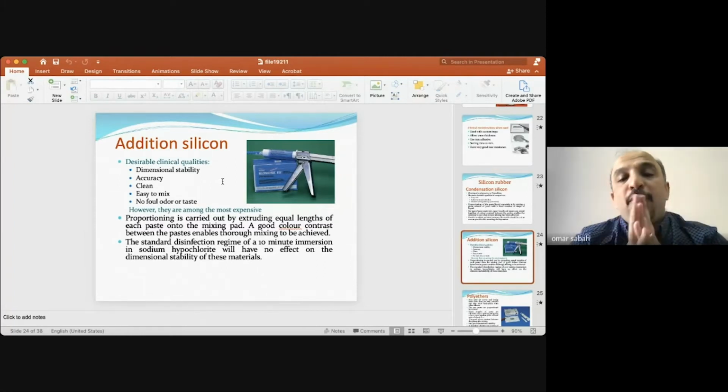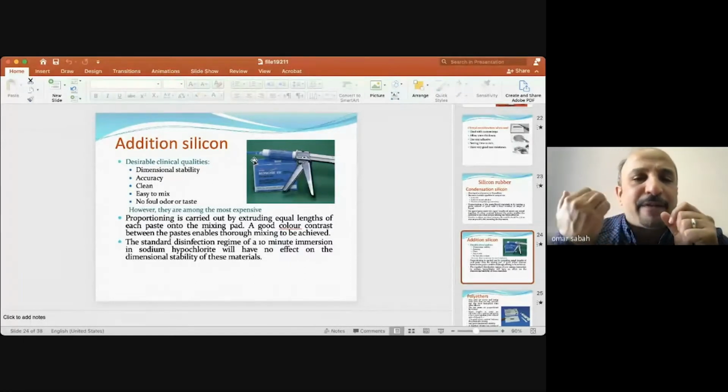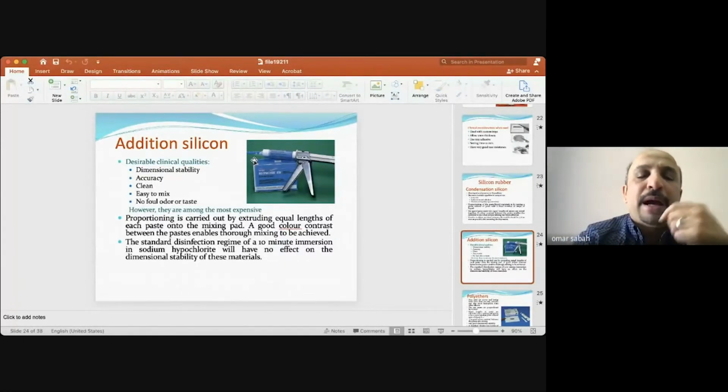Look, some of you maybe need not to waste material during the mixing. What I mean is, when using these mixing tips, you have material staying in them. You lose this material, because you cannot stop the material from the tubes until all the material has gone out of the mixing tips. So some material stays in these mixing tips.